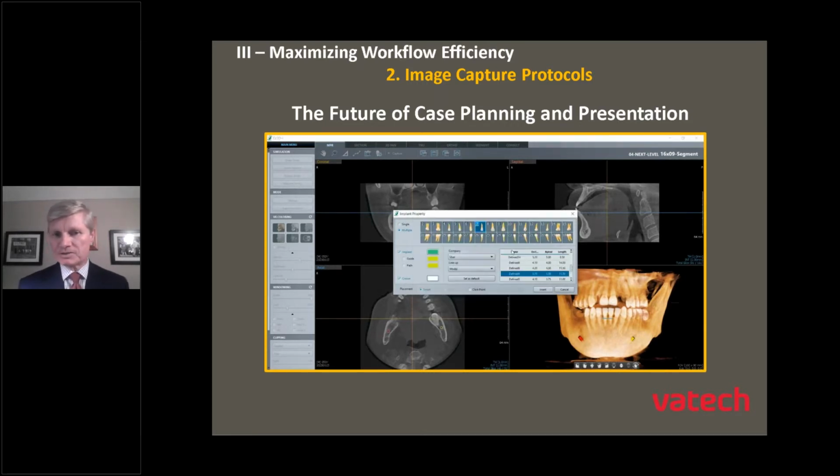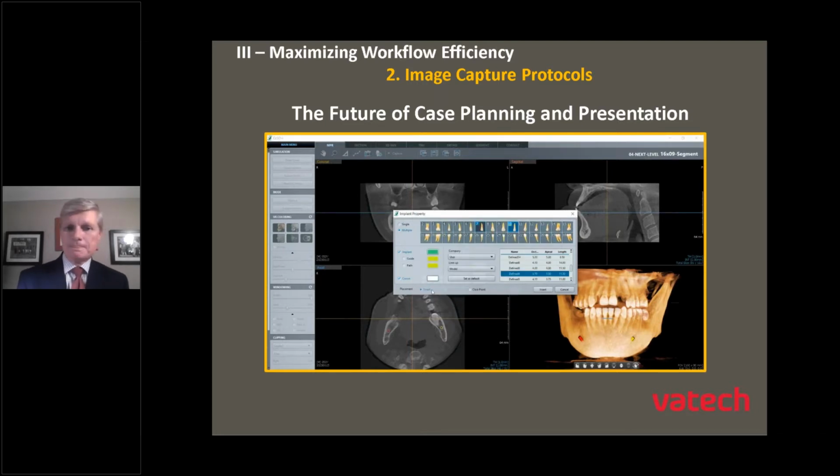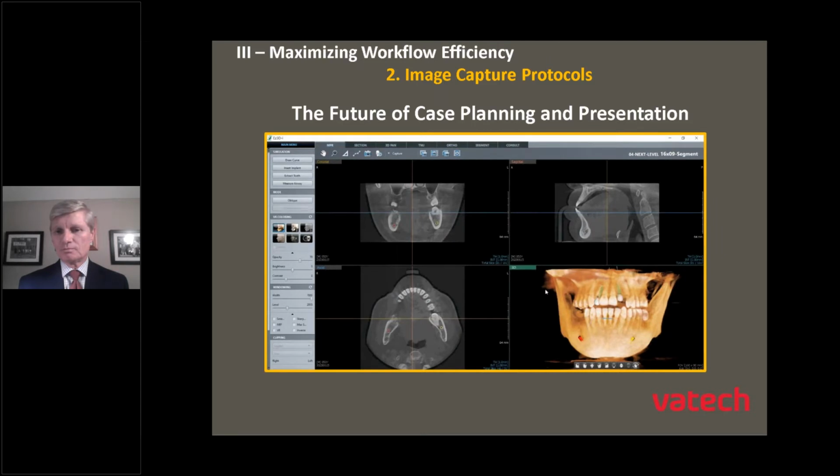I'm actually going to place crowns on there as well for site number 7 and number 10. Click on insert, and now automatically drop those 2 implants in place. Now I chose those specifically because I knew they needed to be edited. So if I right click on the crown, I can even change the size of my crown. If I want to bring it down close to my dentition, I can left click on the implants themselves to line them up with the ridge or the rest of my arch. I can use my controller if I need to rotate the crown, or change the angle of my implant, then I can do that as well.